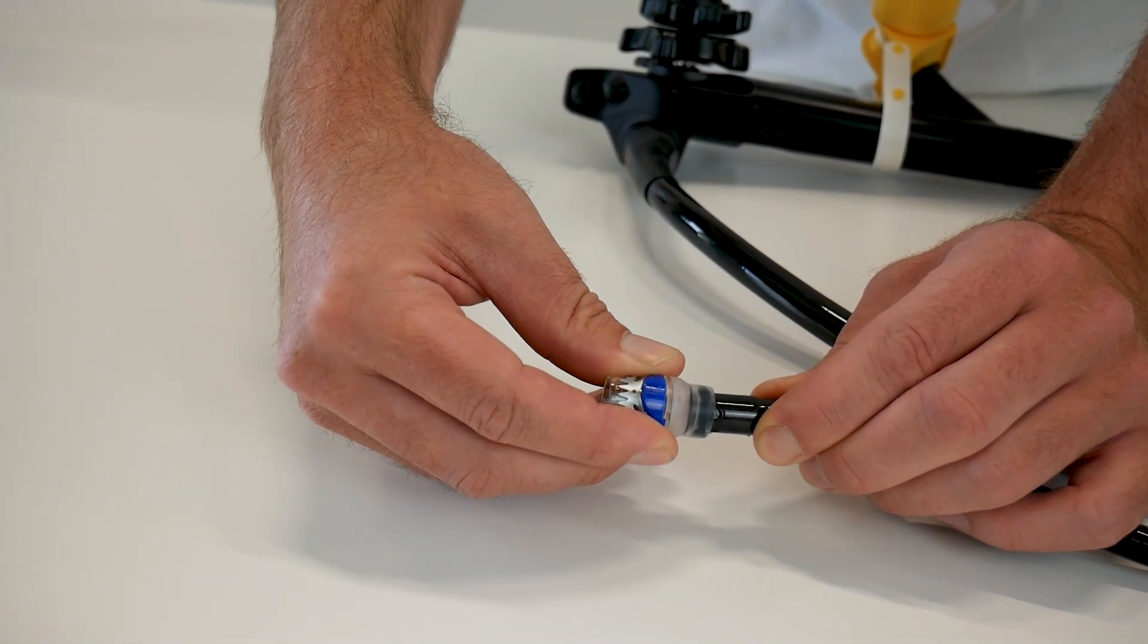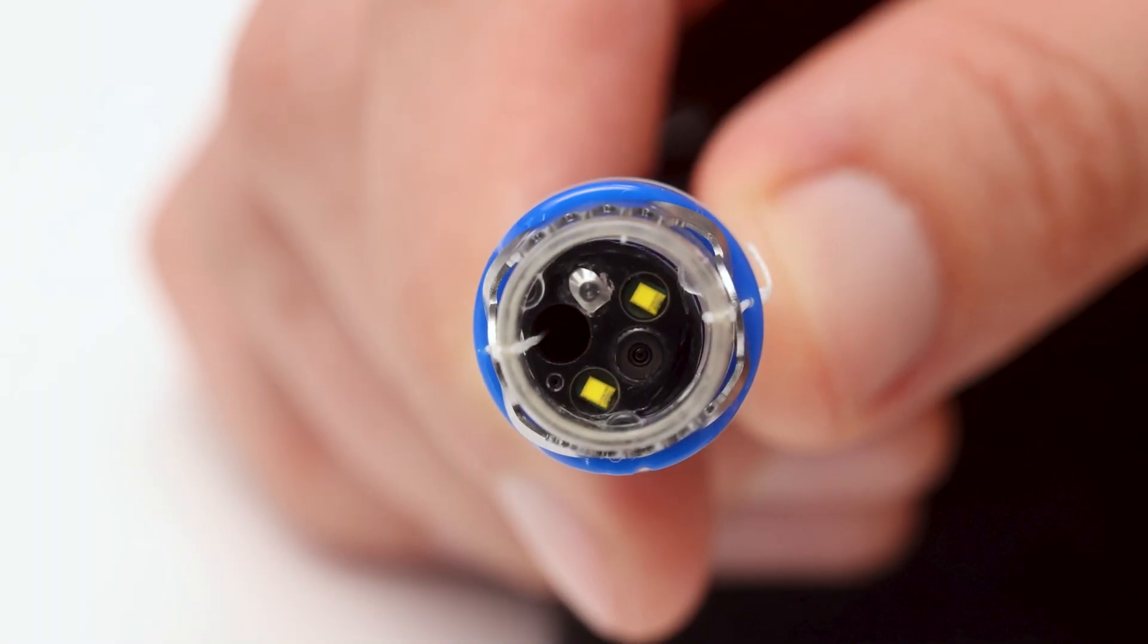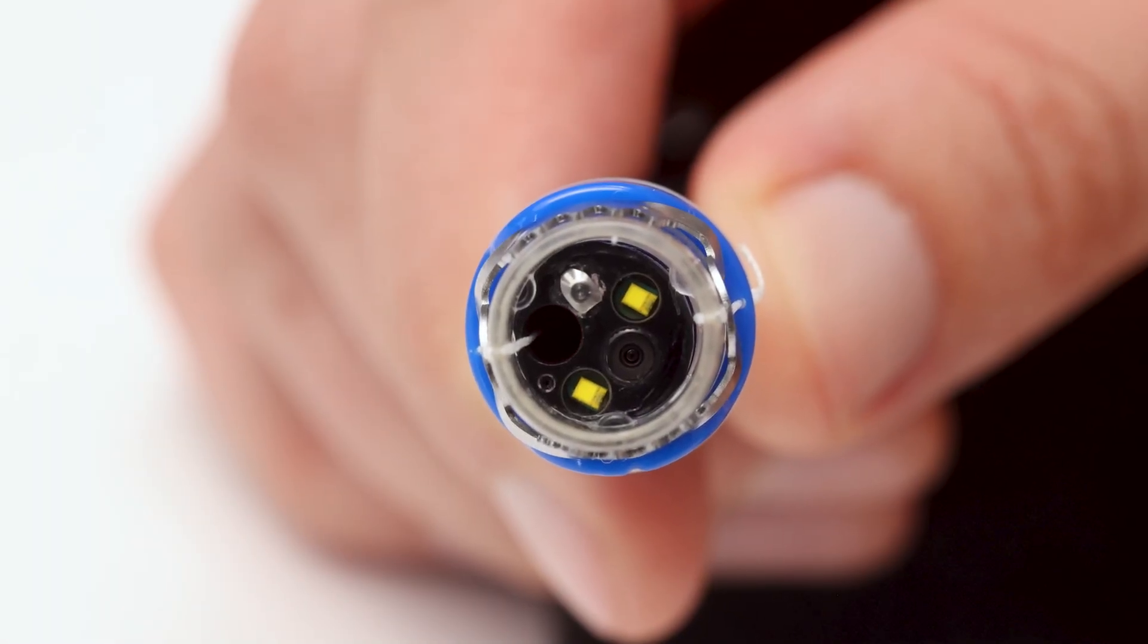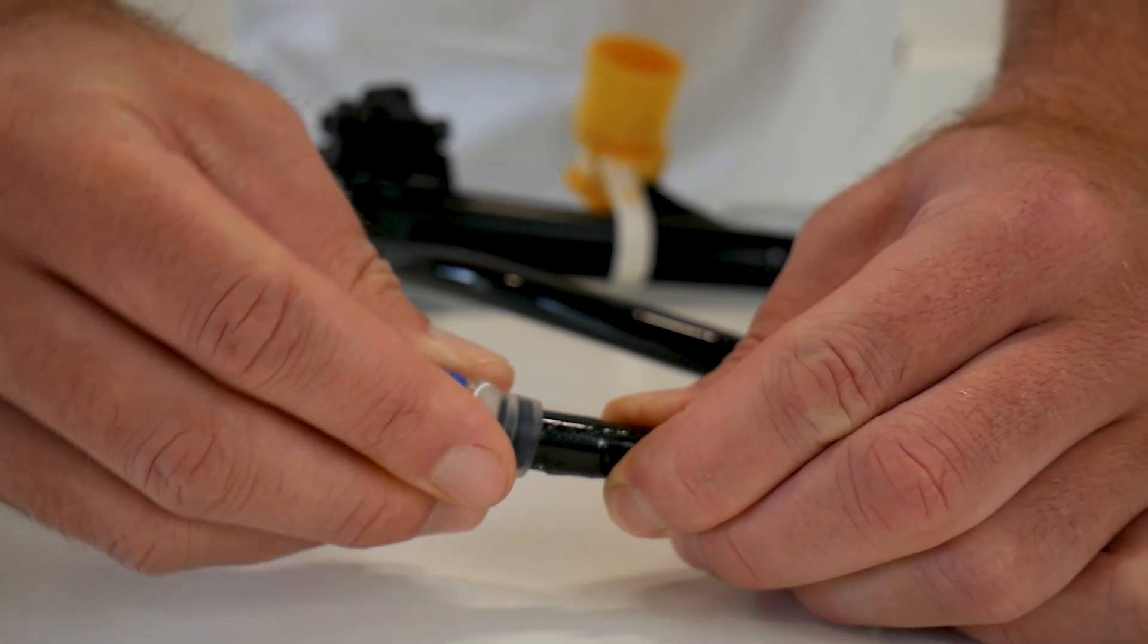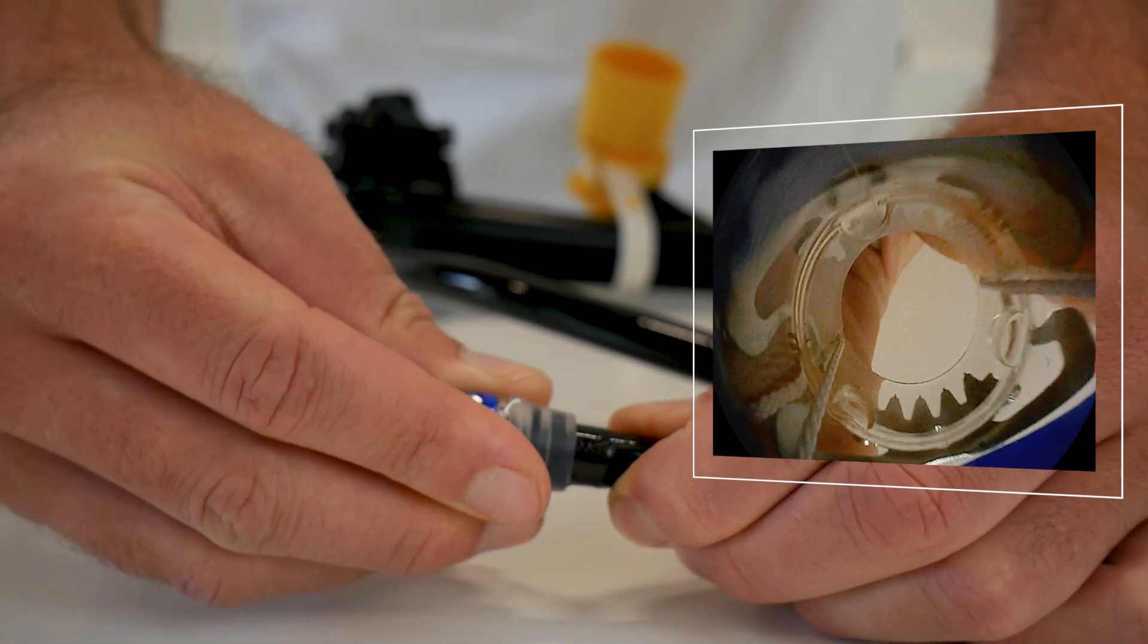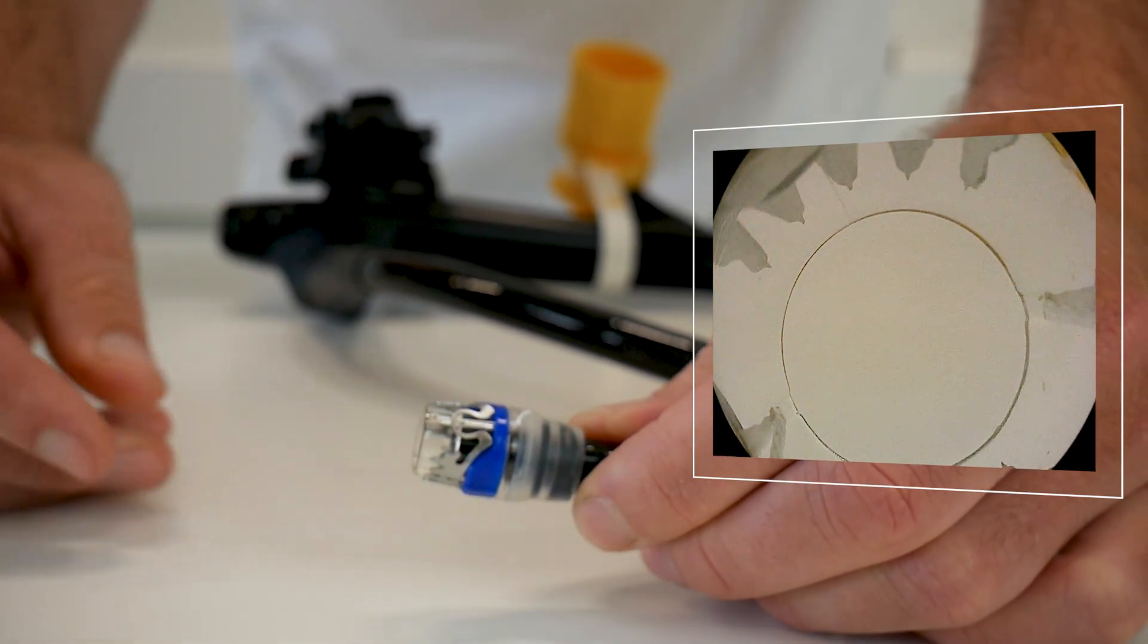Gently place the cap onto the endoscope tip and align it so that the release thread runs vertically through the working channel. Then push the cap onto the endoscope tip as far as it will go. The stoppers serve as a support for clip application and the cap depth limiter prevents too much tissue from being drawn into the cap.